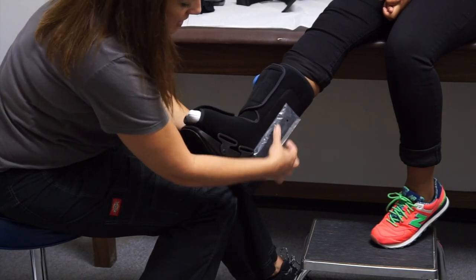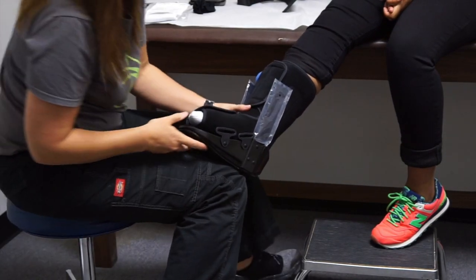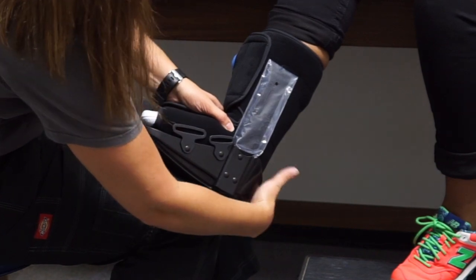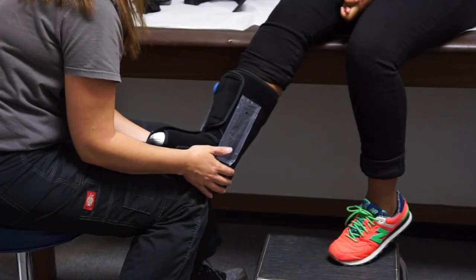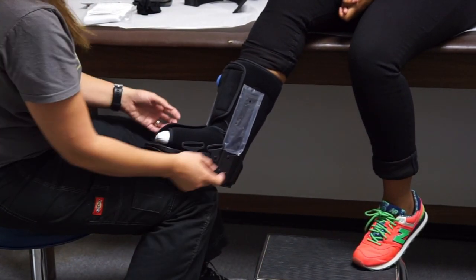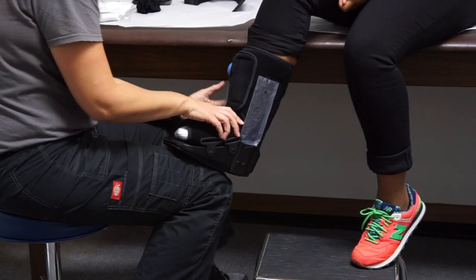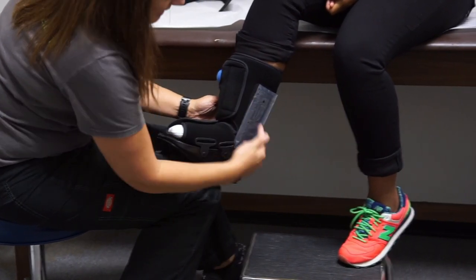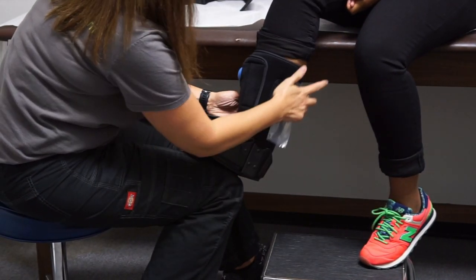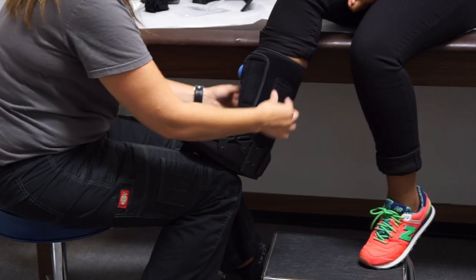The struts are covered with plastic strips — keep those on for now. Have the patient step on your knee, gently push the ankle back so that the heel is flush with the back of the boot, and have them step down. If the patient is too heavy or this is hard to do, you can do it on the floor or a stool. Once we maintain 90 degrees, we slip off the plastic stirrup strip and make sure the struts are adhered to the boot.